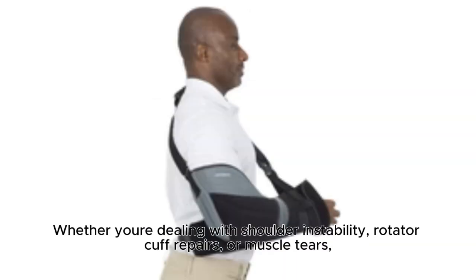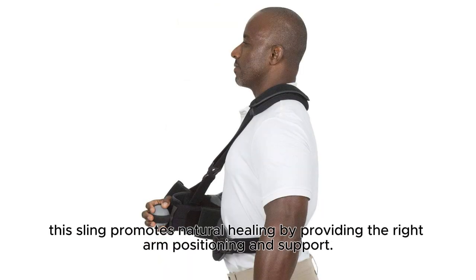Whether you're dealing with shoulder instability, rotator cuff repairs, or muscle tears, this sling promotes natural healing by providing the right arm positioning and support.